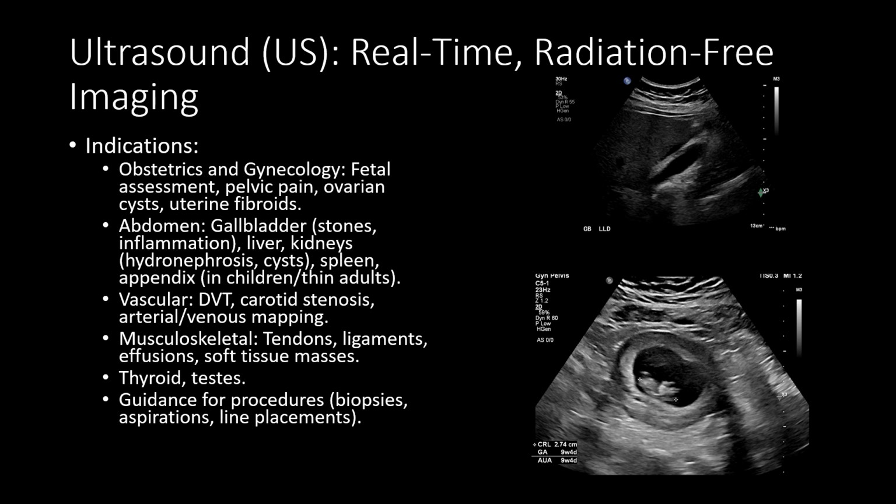Ultrasound imaging, or sonography, is a real-time imaging modality that is radiation-free. And when I say real-time, that just means that there is a person in the room acquiring the images and looking at the images in real time. Some indications for ultrasound include a wide variety of indications within OBGYN, so fetal assessment, pelvic pain, assessing the ovaries, looking for fibroids. It's good in the abdomen for very specific indications like detecting gallstones or cholecystitis, screening the liver for abnormalities, looking at the kidneys for hydronephrosis, or determining whether a nodule on a kidney is a simple cyst.